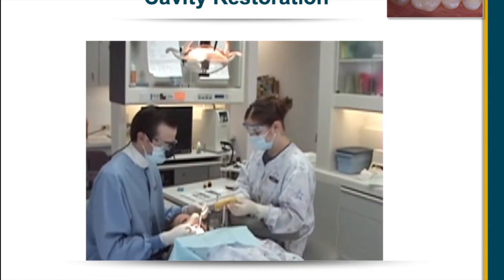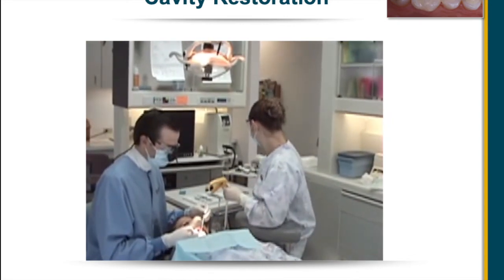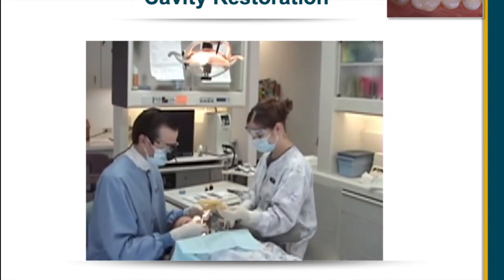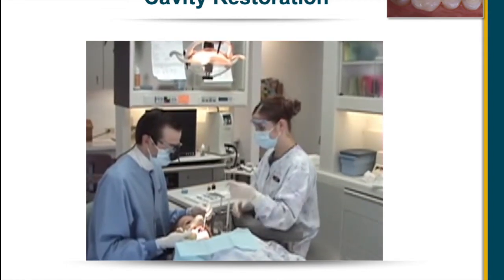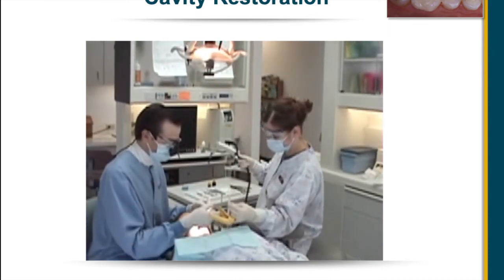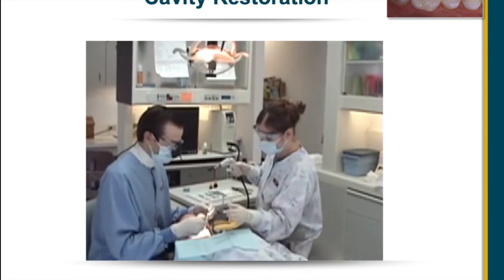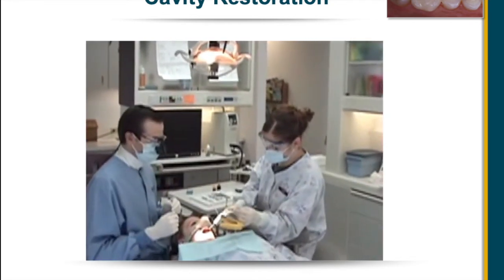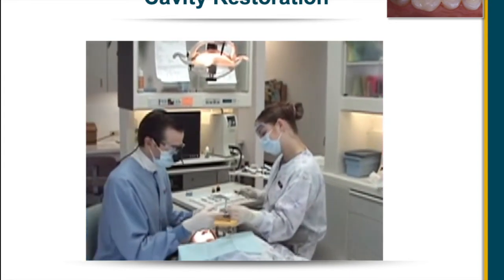Things to note: if the doctor and the assistant were standing side by side, this assistant is considerably shorter than the doctor. However, her head is higher in this position than the doctor's because her chair is much higher than the doctor's. Her feet are comfortably resting on the footrest that is associated with an assistant stool, and her elbows are resting on the armrest of the assistant stool.